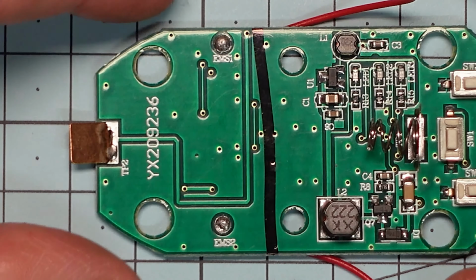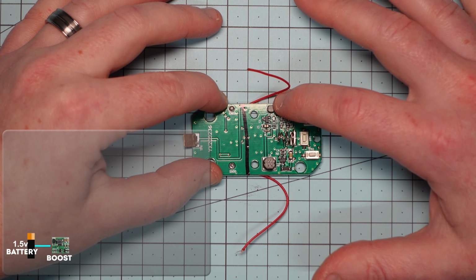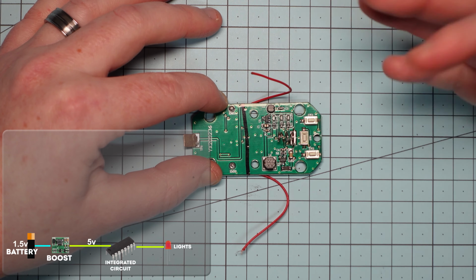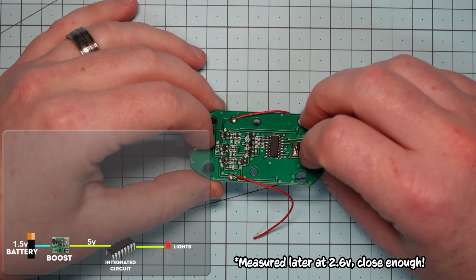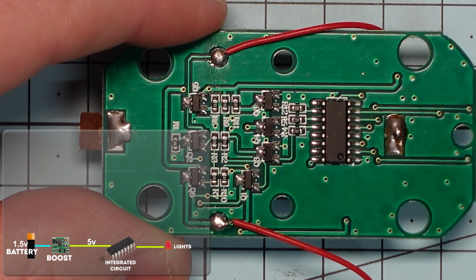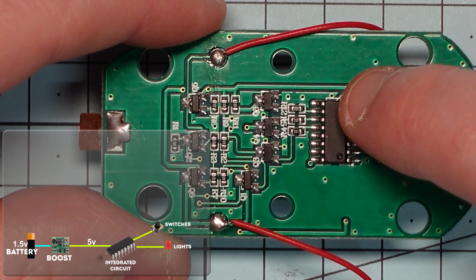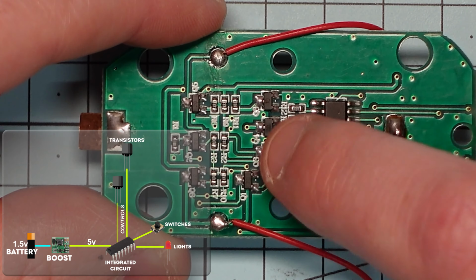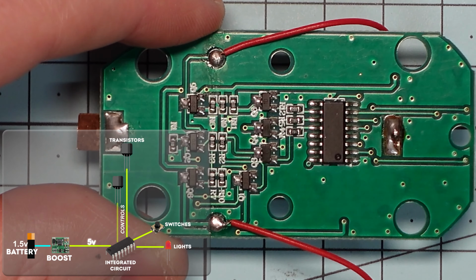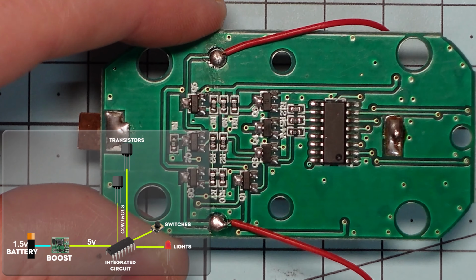So how does it work? Well, 1.5 volts comes in from the battery. It's going over here to be boosted up a bit, enough for the IC and the LEDs to be powered, so maybe 5 volts or so. Your IC is powered up. It knows what mode it's in when it starts. It's in hand mode. You might press some of the buttons to move it to a different mode. Now there's 3 transistors here, electronic switches. Now, it's only got 5 volts, remember, we boosted up 1.5 to 5 volts, which is not going to be enough to give you that zap.